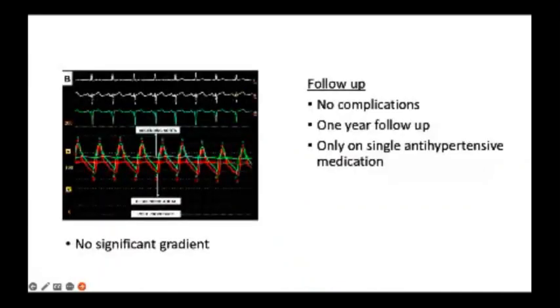And finally, there was no gradient, and at 1 year follow-up there was no complication, and the patient is now on a single anti-hypertensive medication with the BP of 120/80.